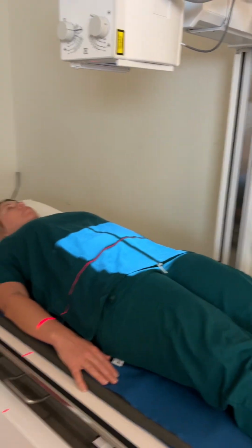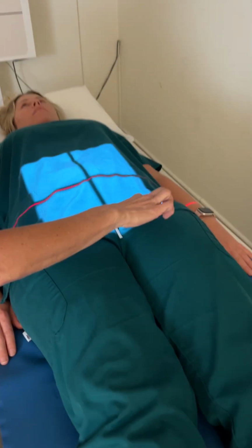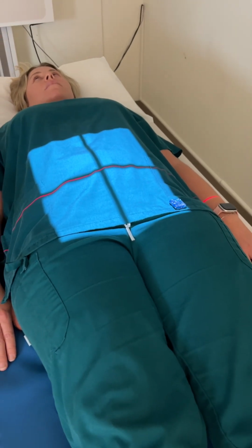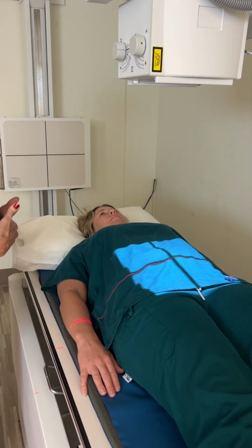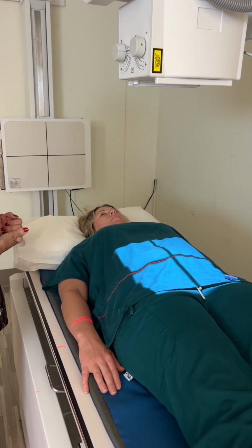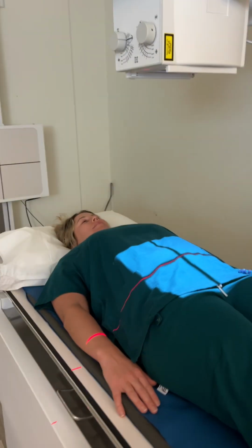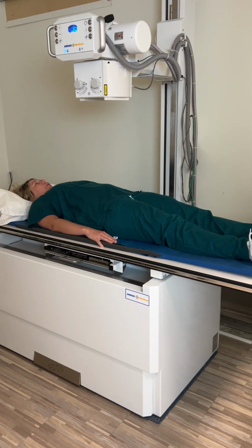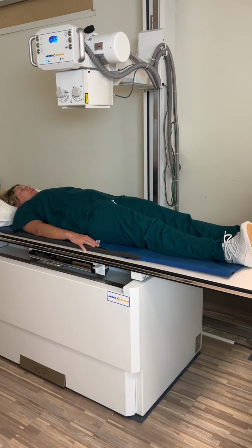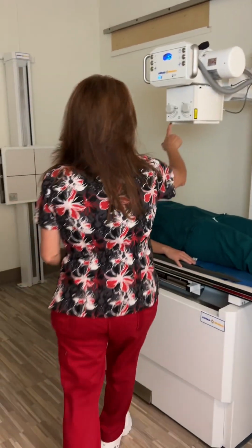And we're gonna put left marker down, and that marker likely will show up in her femur, which is not pertinent anatomy. So I'm gonna have you do the same breathing where you're gonna breathe in and then blow it out and hold it out, okay? Okay, go ahead and take in a deep breath. Blow it all out. Hold it out, don't breathe. Beep, good, you can breathe and relax.